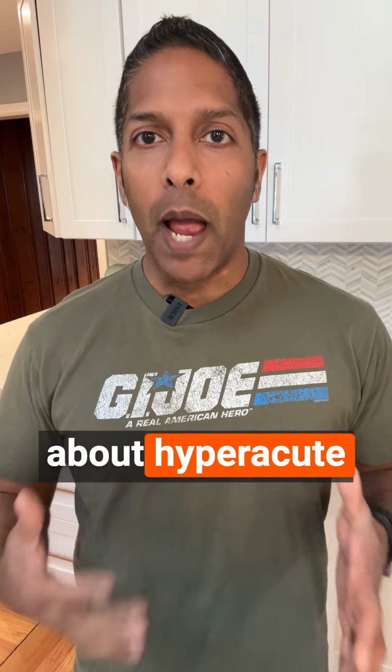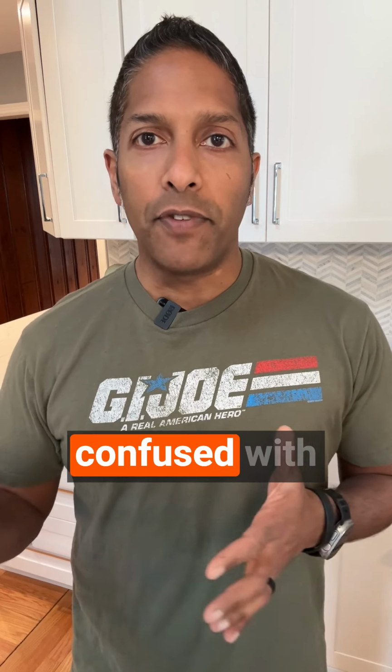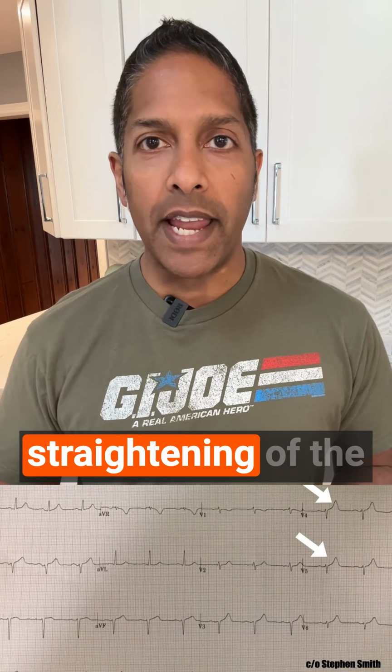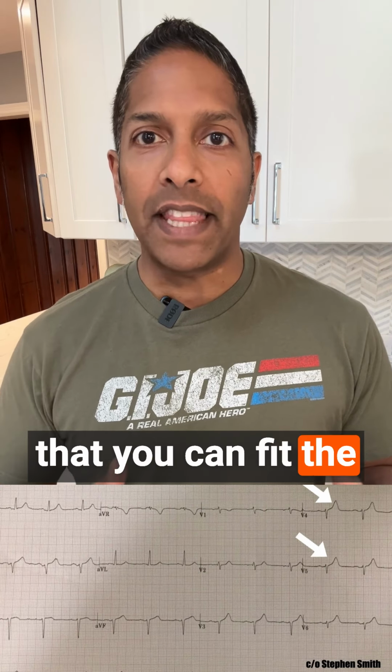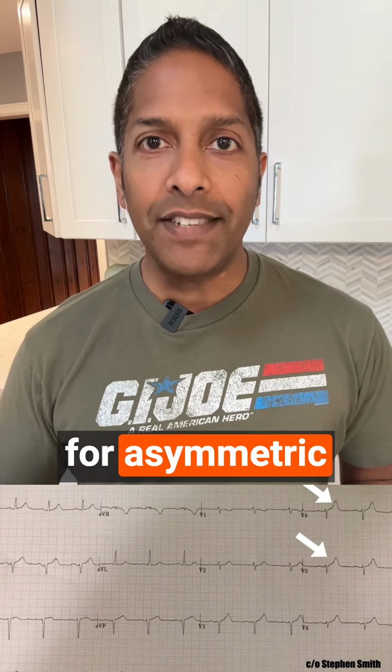Tip number two is about hyperacute T waves, which can be very difficult to diagnose. They're often confused with peaked T waves, and the morphology features that we are looking for are a straightening of the ST segment before the T wave, a large enough T wave that you can fit the entire preceding QRS complex under it, and we're looking for asymmetric T waves.